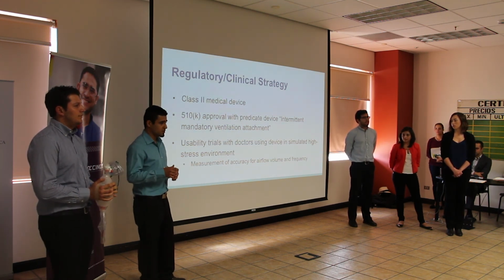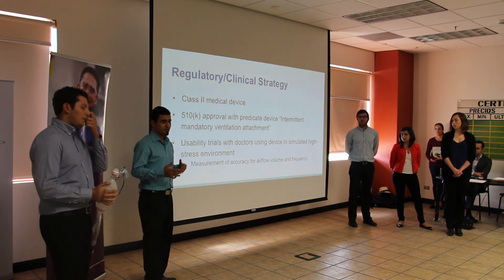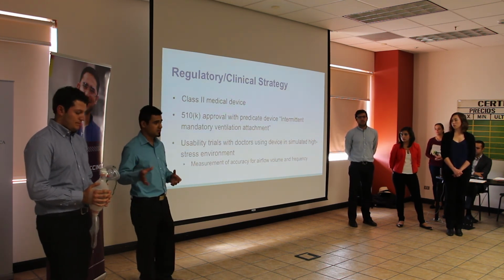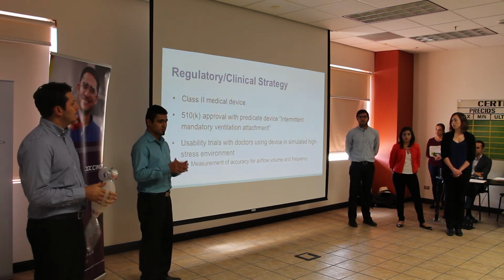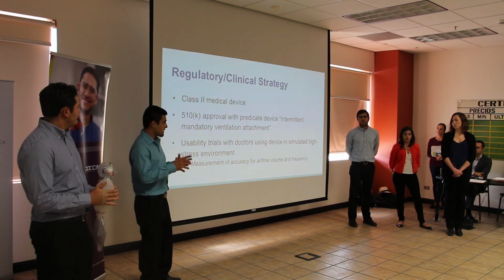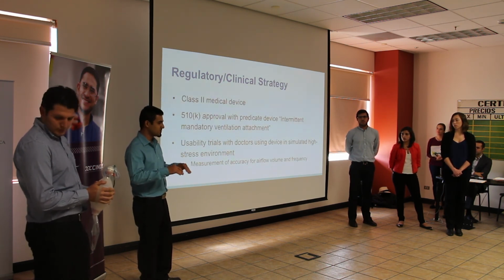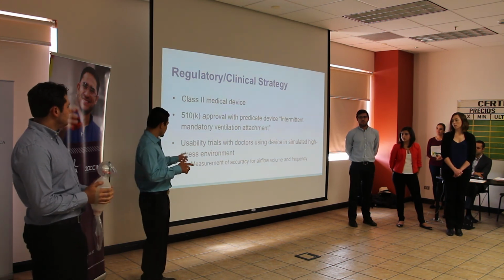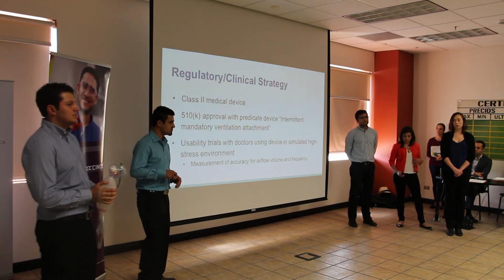As a team, we thought that doctors, nurses, paramedics, and other people that handle the device should perform ventilations on manikins that are used in medical research, in a very high stress situation, to measure the correct volume of air and the right frequency when it's used.